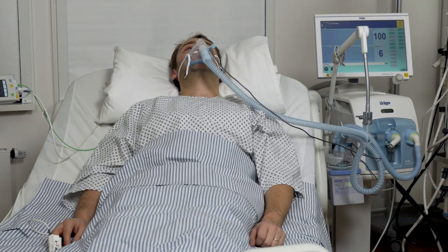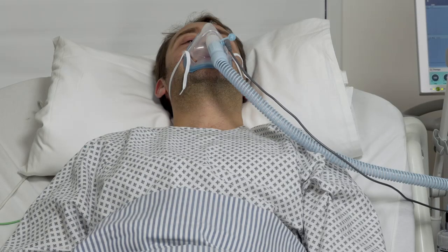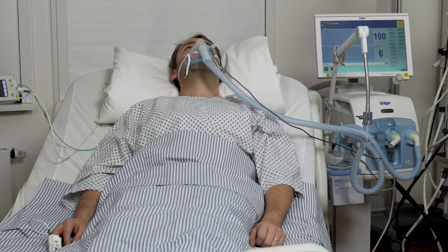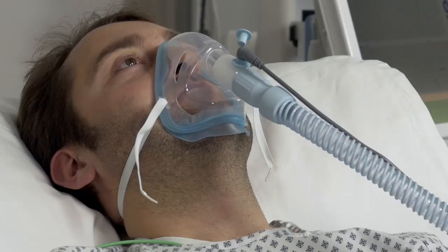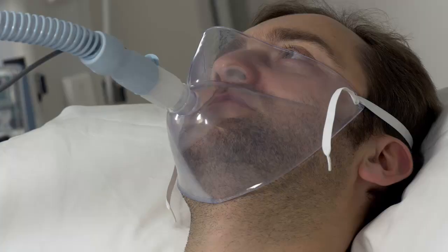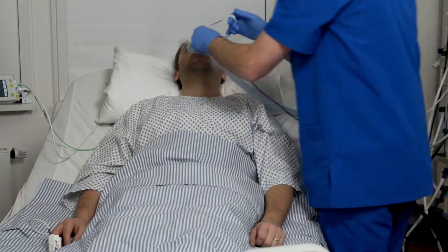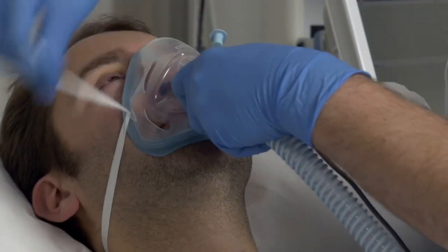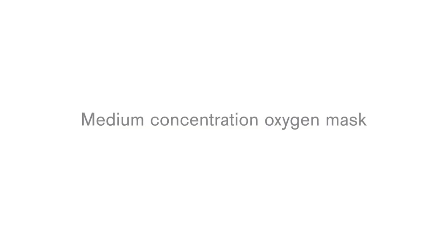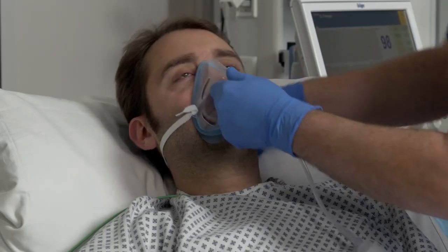This chapter shows the preparation of special O2 therapy accessories for use on patients in combination with an intensive care ventilator. The following products can be used with Draeger intensive care ventilators with the Oxygen Therapy option: oxygen and aerosol mask, medium concentration oxygen mask via connector kit, tracheostomy mask, and face tent. Here you can see the setup of the oxygen mask with MR850 humidifier and heated tubes. This mask is connected directly to the 22mm connector of the inspiratory breathing tube. The medium concentration oxygen mask can be connected to the 22mm connector of the inspiratory breathing tube with the help of the O2 Star Connector Kit.